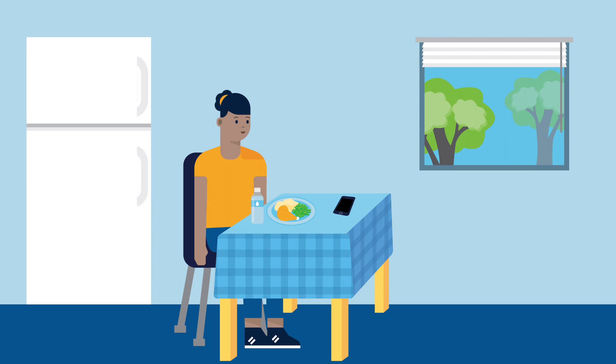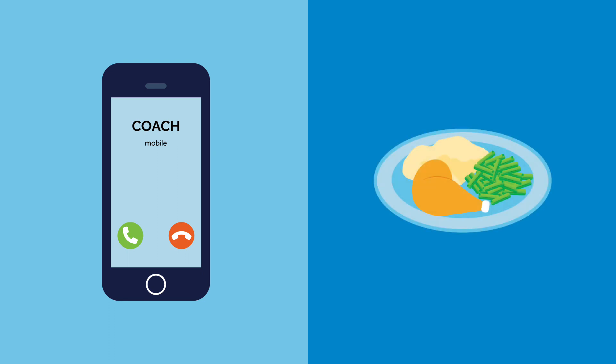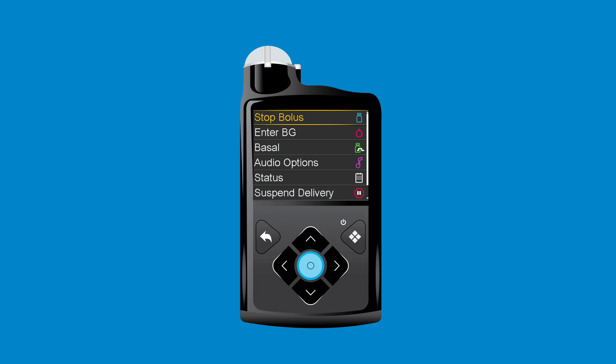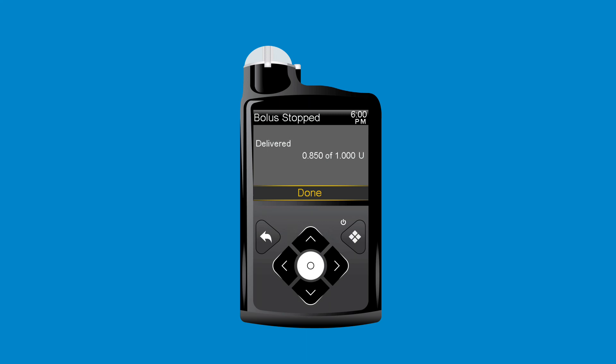Later that evening, Anna sits down to eat dinner. She starts to deliver a bolus when her swim coach calls. Anna is sure the call will take a while and she wants to wait until she gets off the phone to eat. She uses the Stop Bolus option to stop the bolus delivery. Anna presses Select to open the menu, selects Stop Bolus, presses Right and selects Yes. She reviews the Bolus Stopped screen to see how much of the bolus was delivered and selects Done.